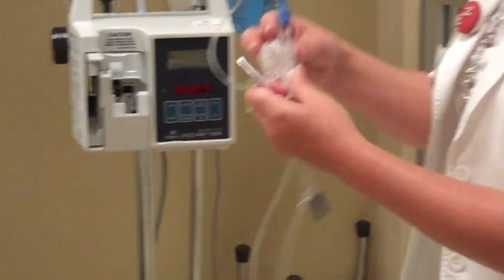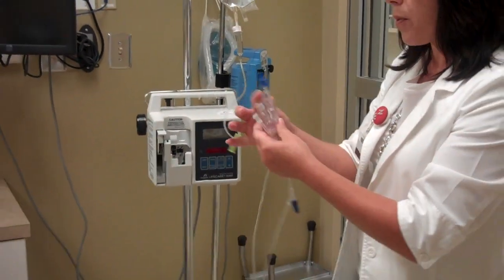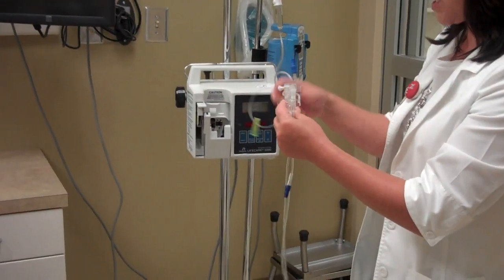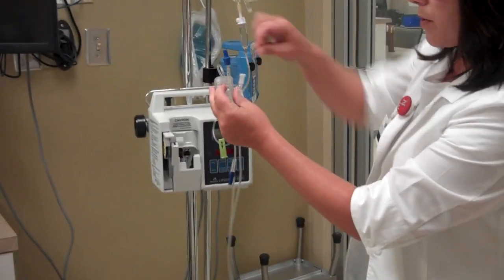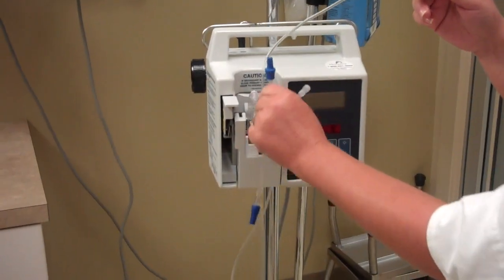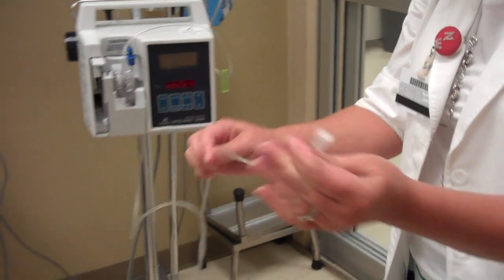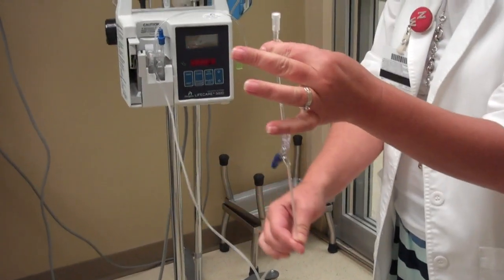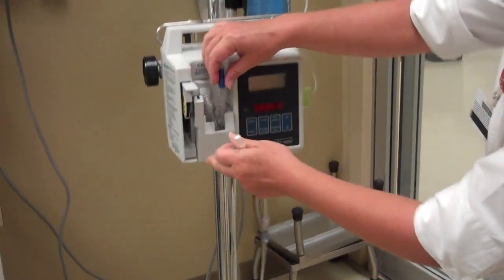At this point, you could either wait and push the white cap back in to make the fluid stop, or you could go ahead and slide it in the pump and just close the pump to make the fluid stop. There's a little hand grip so you can hold here to slide it into the pump. Wait for the fluid to get to the end, give it a little pop so bubbles come to the top, and it is primed all the way. Close it.